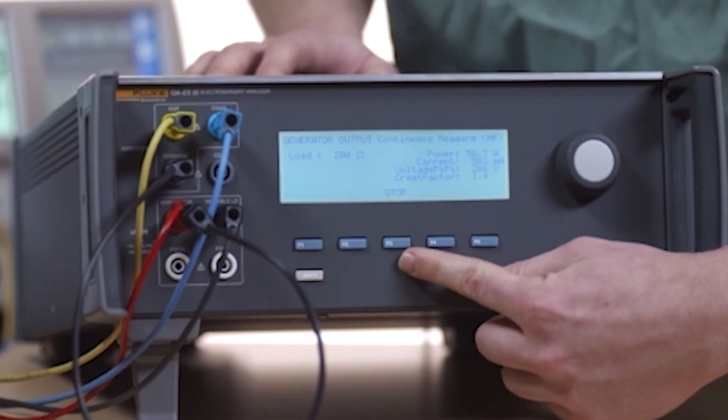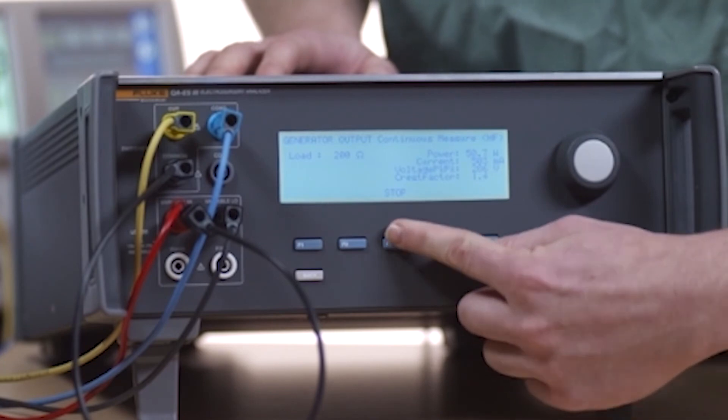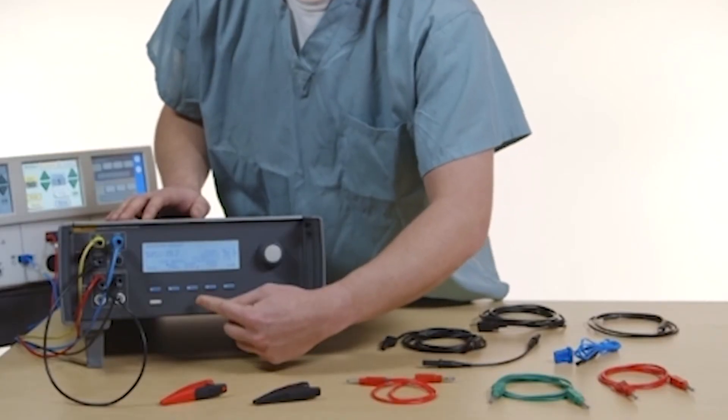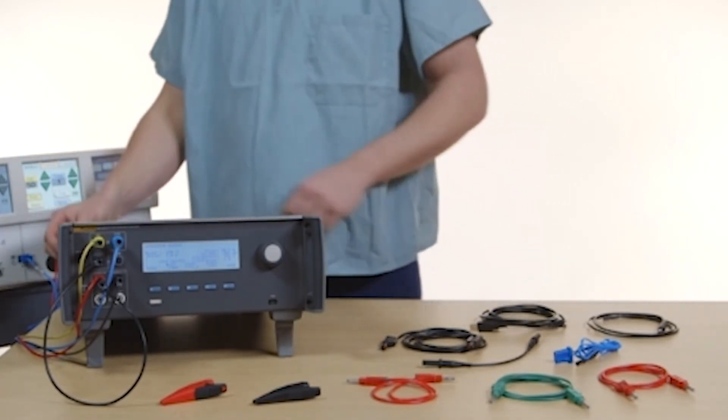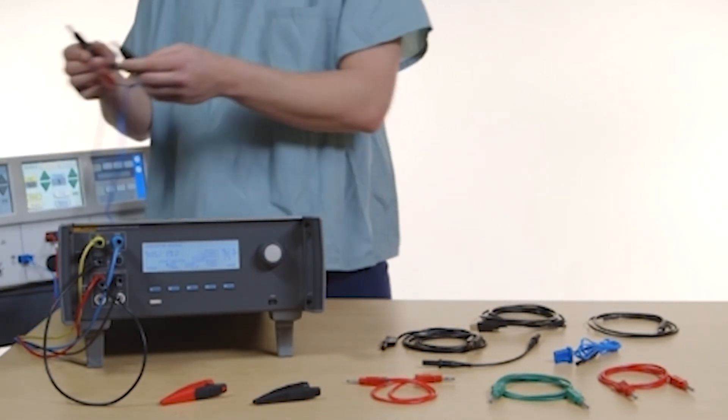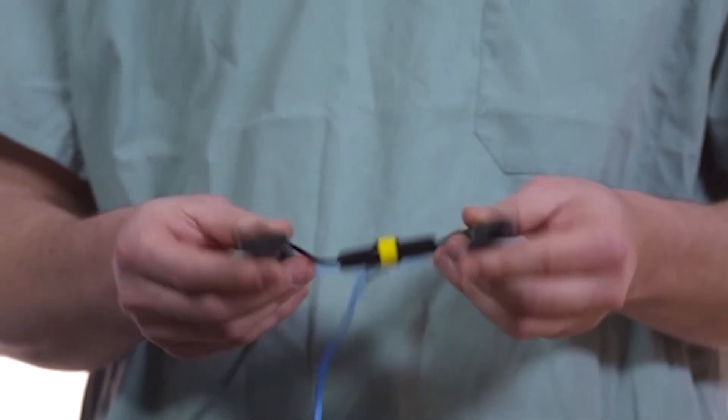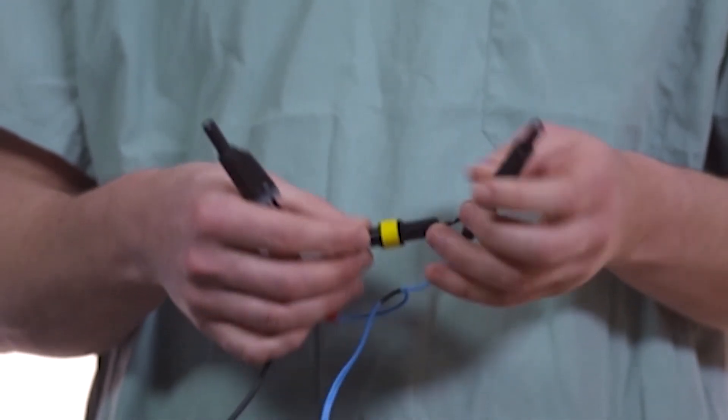Note, the ESU remains on and the footswitch is engaged until you stop the measurement. ESUs with CQM alarms have two neutral connections. You must connect the neutral connections together for generator output, vessel sealing, and HF leakage measurements.